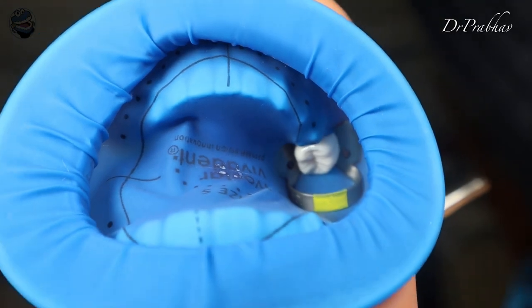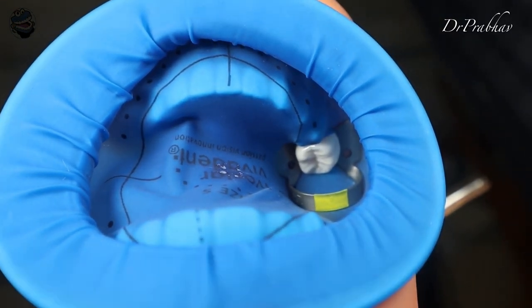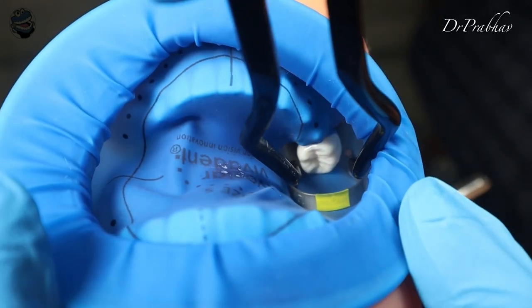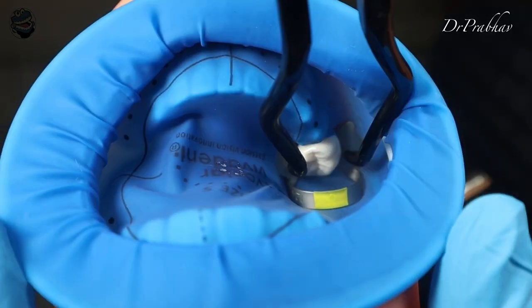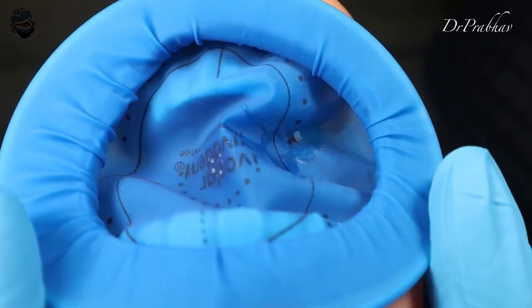But we thought how would he be happy, how would he eat? So we need to remove it. What we did was we just again disengage first the clamp from his mouth so that we will be able to disengage the OptraDam.